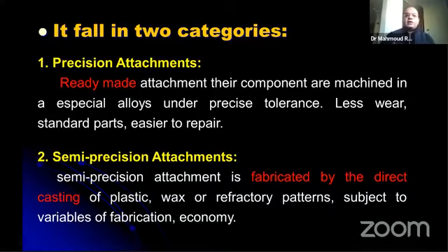For some types of the semi-precision attachment, you can buy only a plastic pattern and make a casting for it.